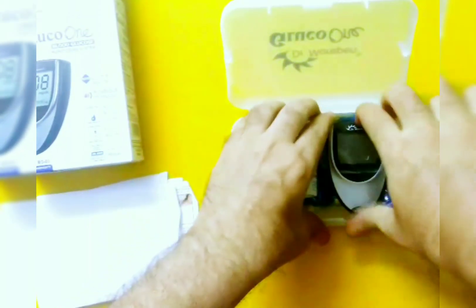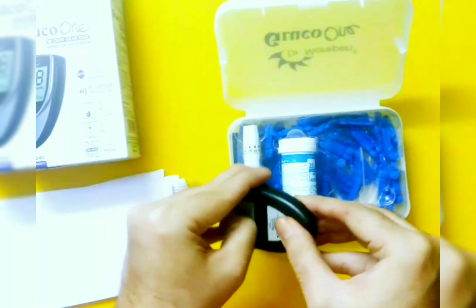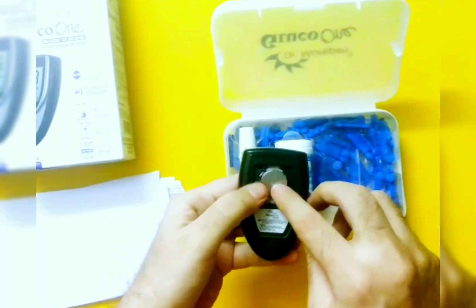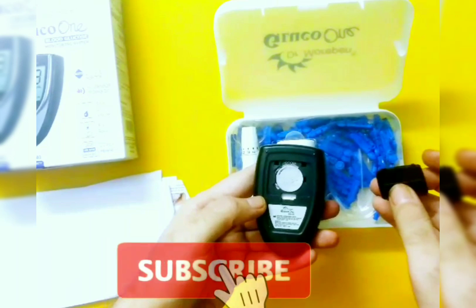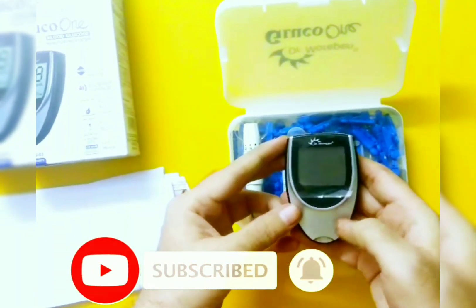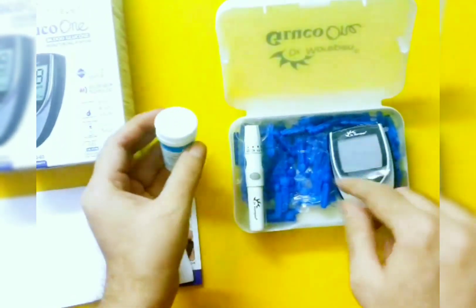The lancet is added into the lancing device, and these are the test strips which I bought separately. The main glucometer — I put the battery over here. It's a CR2032 battery, which is a button cell used in weighing machines and car remotes. As soon as you put a test strip, it will switch on automatically.